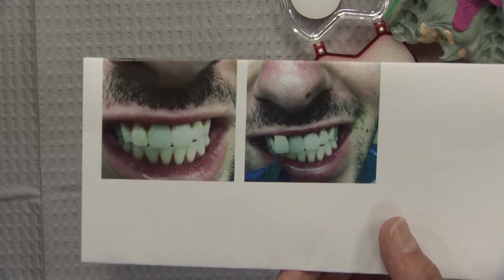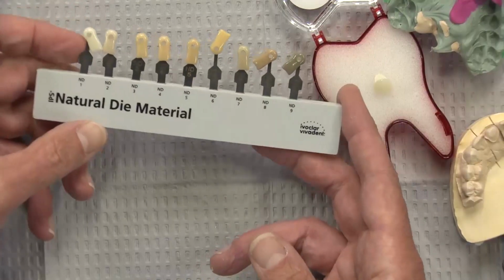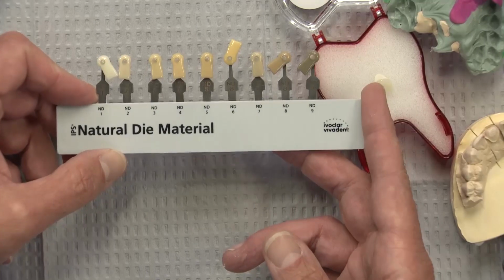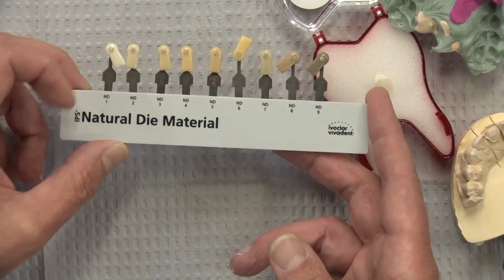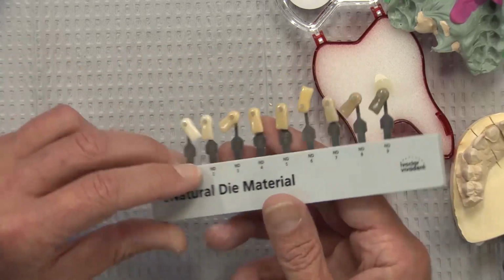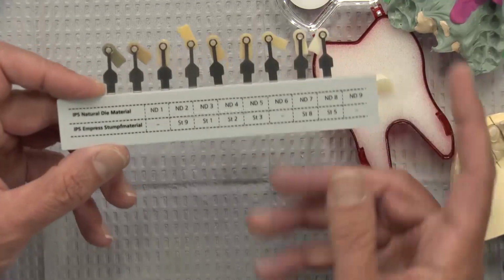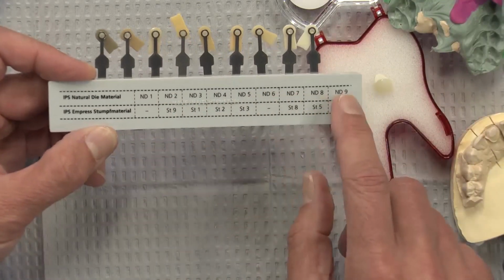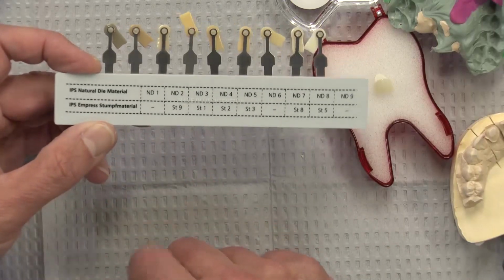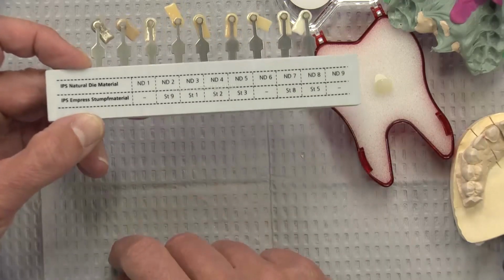What we use in the lab is pretty much the standard, and that's the Ivoclar Vivadent Natural Die material. If you used to do Empress veneers, you might have an old one of these with ST on it, which we used to say for stump shade. If you flip the new Natural Die guide over, you'll see how these shades relate to what was really those ST shades, the Empress stump material. Stump with an F. Thanks to the Germans for throwing that in there to make it impossible to pronounce.